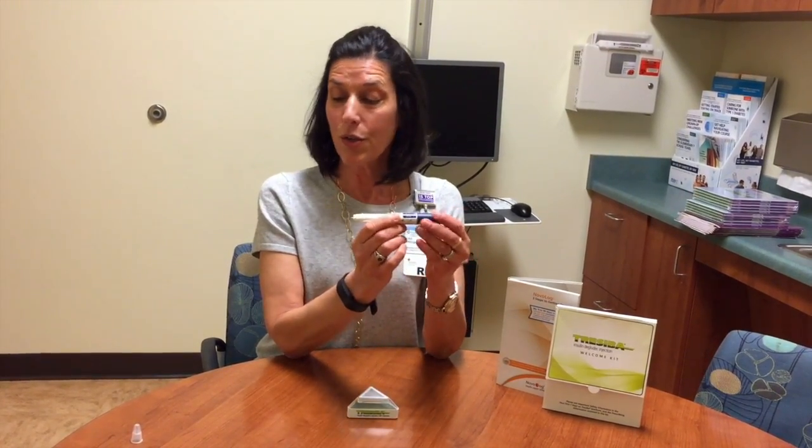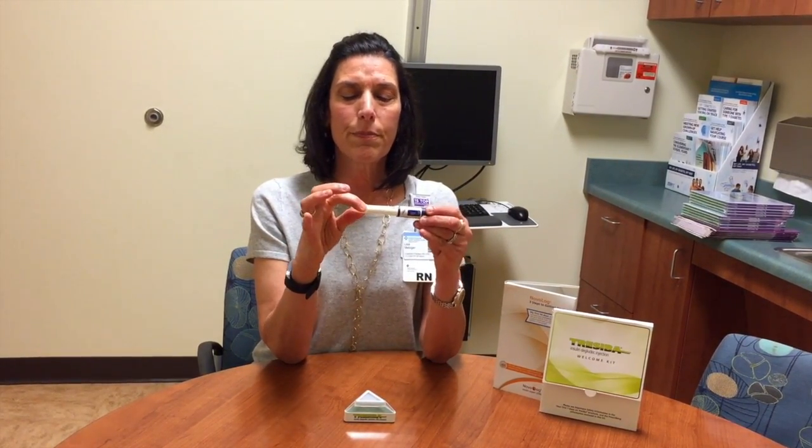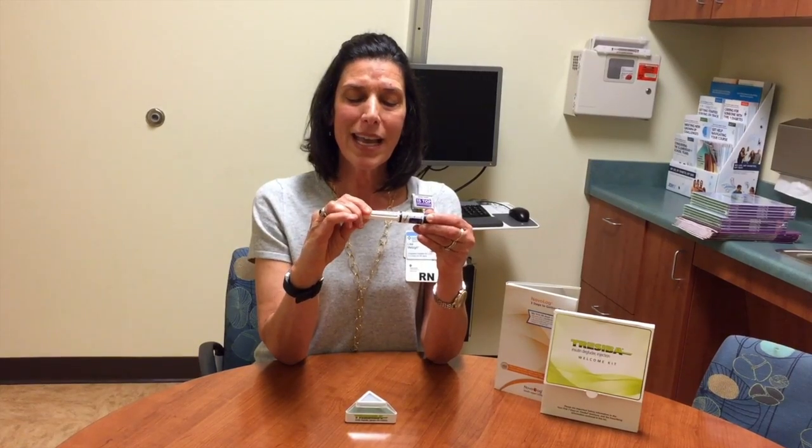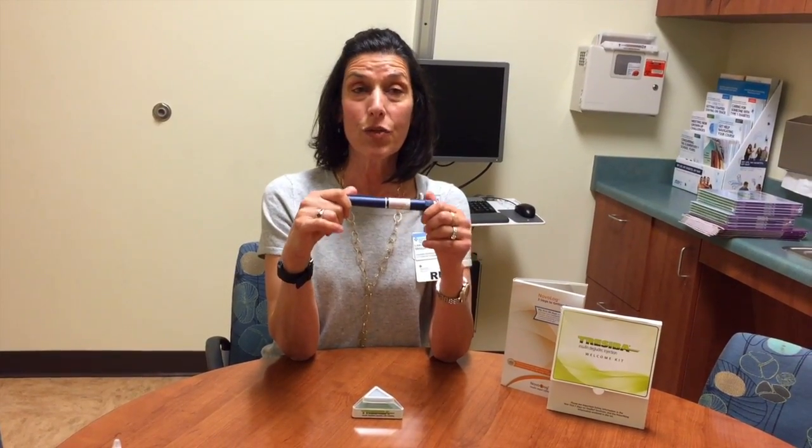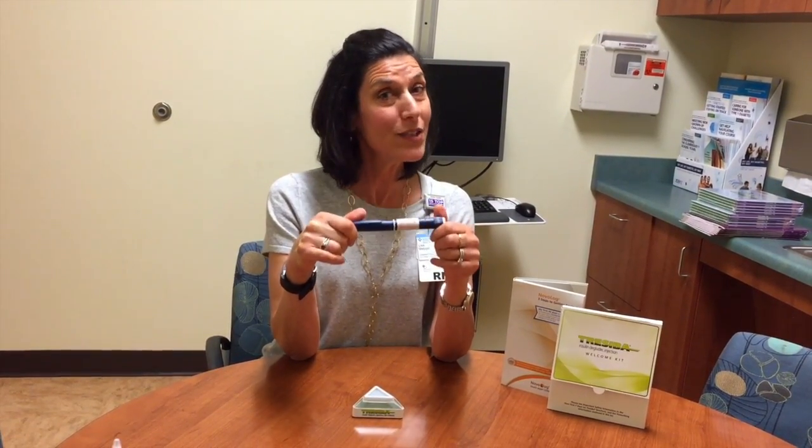Then what you're going to do is grab the outer pen needle that we talked about earlier and just pop it on to the pen needle. You kind of need to squeeze it a little bit and then turn it counterclockwise until it comes off. Then immediately discard it in a sharps container, and then you're going to recap your pen. And that's it for today's demonstration of the Tresiba pen. Hope to see you in PENS soon.